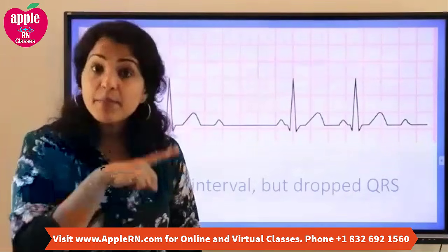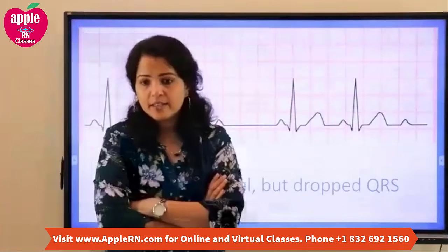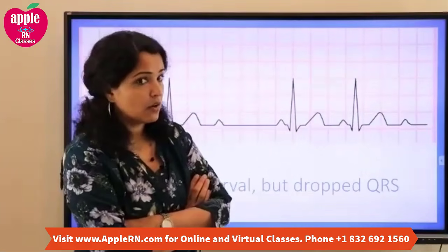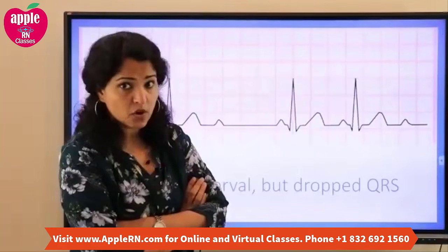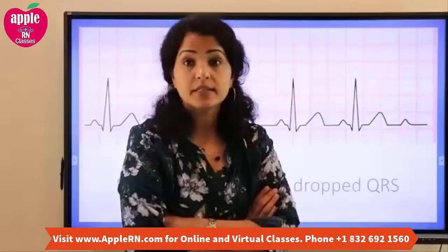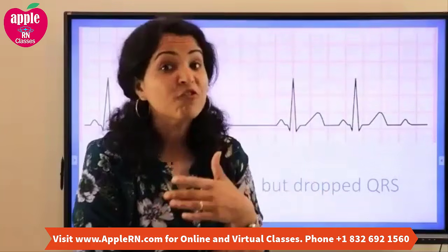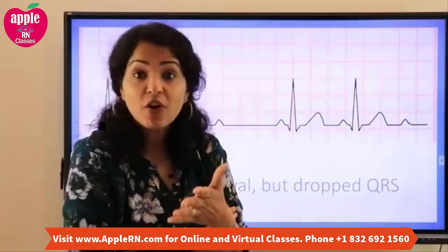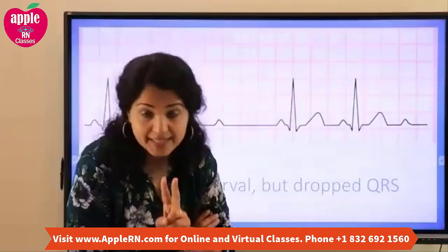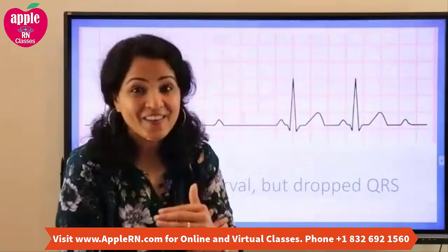Because in type 1, we had enough warning sign. The wife was waiting there and she was like, today he comes at 5, very good. Tomorrow he's at 6, oh, that's not a problem. So there's something wrong. Then the next day he's coming at 7, oh, that's even worse. And then the next day he doesn't come. That's really bad. So we had enough warning sign before there was a drop in QRS. That's second degree type 1. The PR interval gets longer and longer and longer.